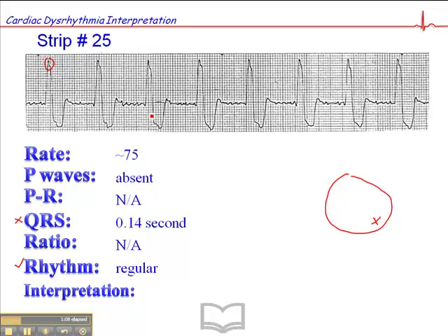You might ask yourself, could this not be atrial fibrillation? The answer is no. You might look at these and think maybe these are fibrillatory waves, but you cannot have a perfectly regular rhythm with atrial fibrillation. That is not possible. So it definitely cannot be atrial fibrillation.